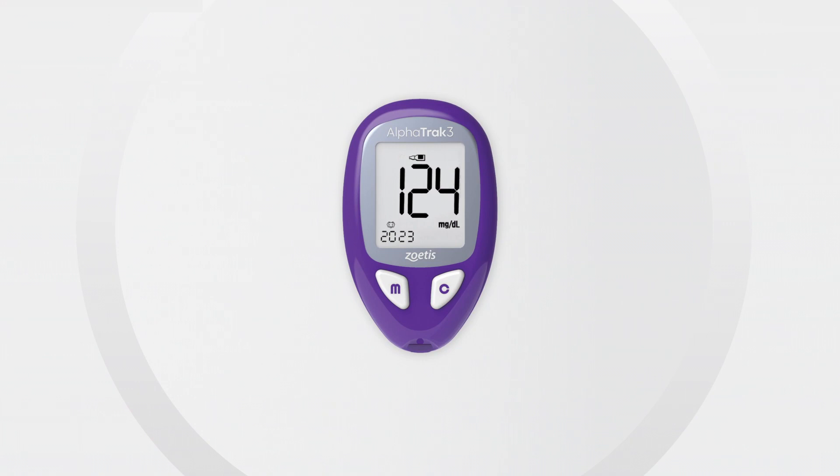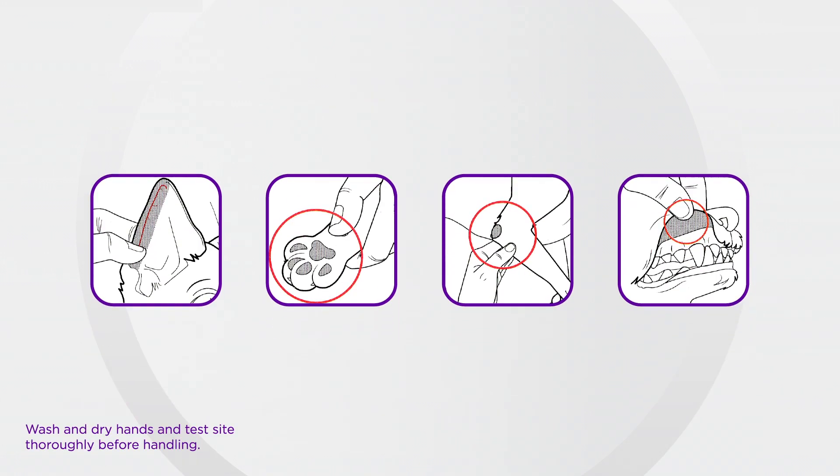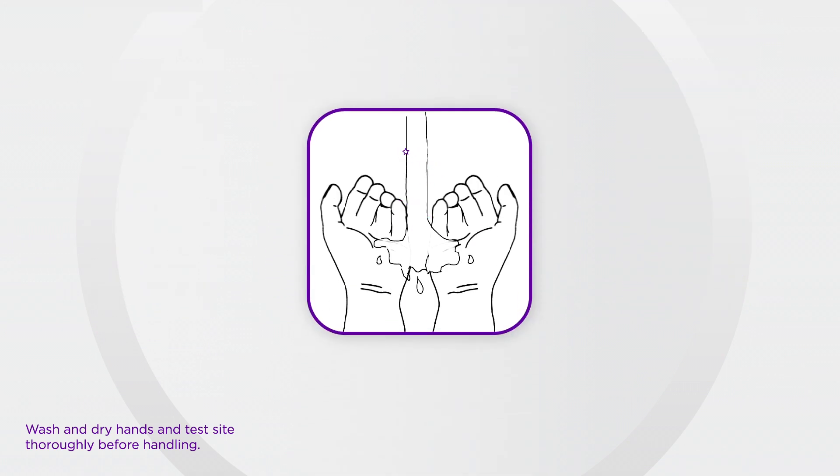After performing a control test, you can prepare to use your meter by selecting the sample site. Before handling the sampling site, we recommend washing your hands and the sampling site with soap and warm water and drying thoroughly.